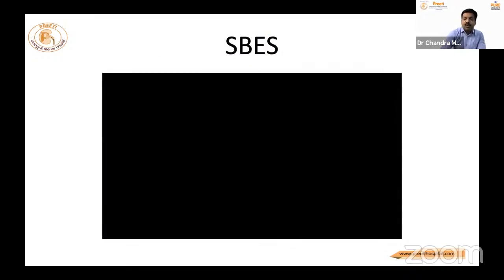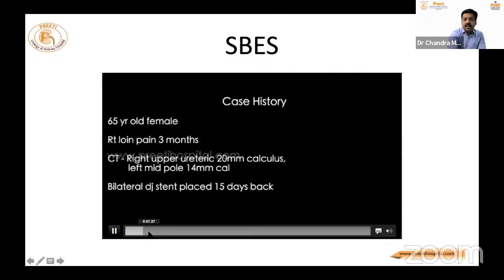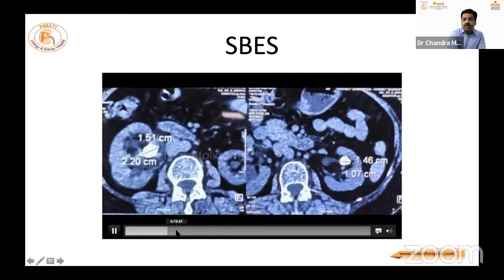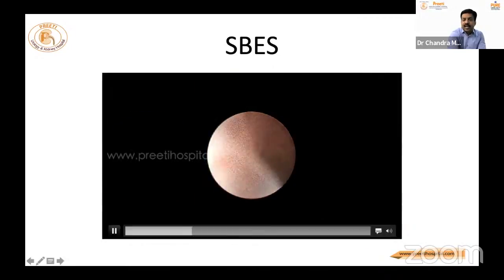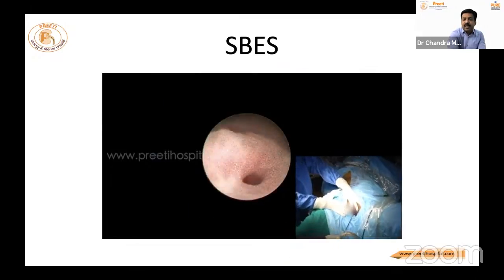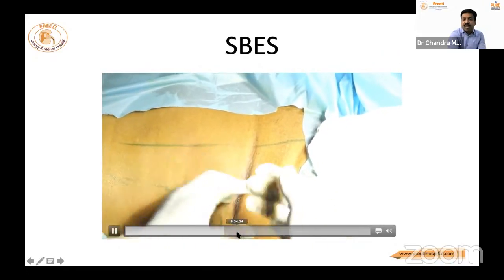The last case is simultaneous bilateral endoscopic surgery, an extension of ECIRS. Again, this is the last video I am showing. So basically, you have a 65-year-old female patient who has breathlessness, who cannot come for anesthesia, and you see one side a large stone, one side a small stone, same position for all the procedures. First, you get access to one side. This is for PCNL, a very easy case, so anybody can puncture and do it. On the other side, you put the access sheath. Now both, first you puncture the kidney.